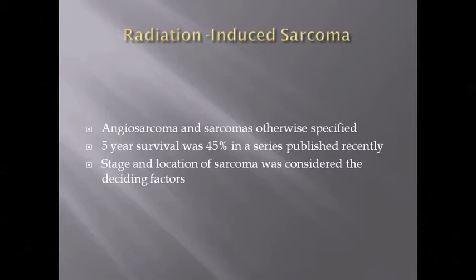So I think I have taken you through a spectrum of cases of spindle cell proliferation within the dermis.